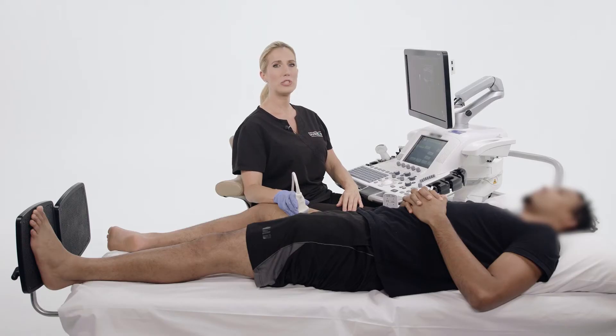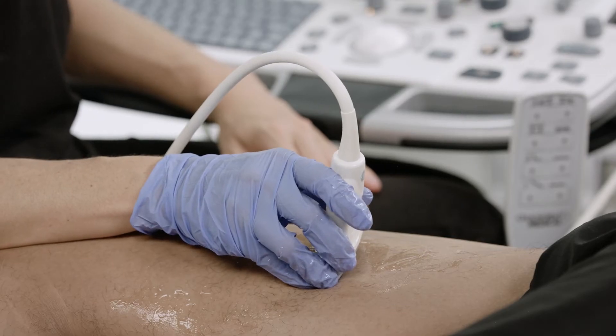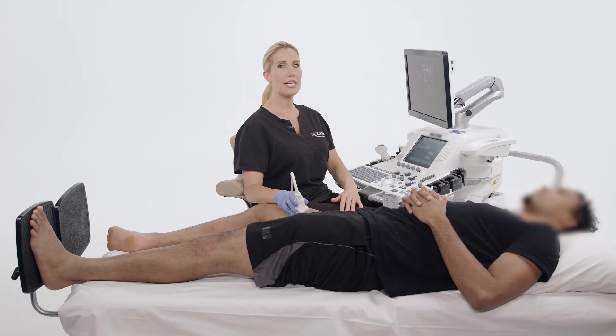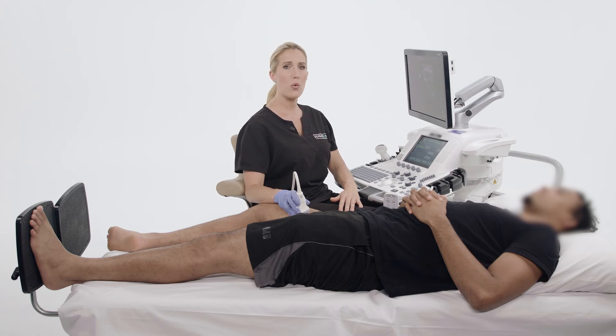Now that we are holding our transducer correctly, we need to be mindful of the transducer pressure that we are exerting. If you need to apply too much transducer pressure in order to properly image your target vessel, you are either failing to optimize your image or your transducer frequency is too high. Most of the time, applying proper image optimization or decreasing the transducer frequency should rectify the issue.